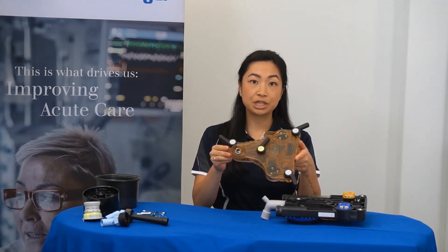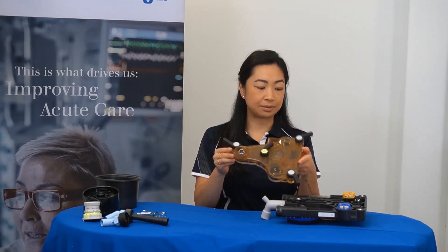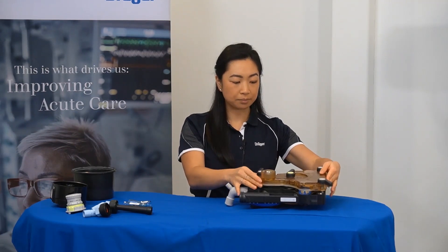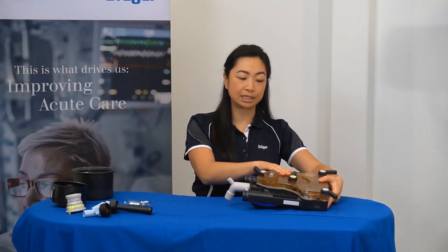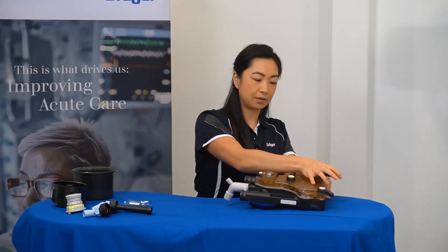Now, to return the cover to the breathing system. Align the cover up to its base. Ensure the grey levers remain open to allow you to attach the cover, and then close the levers.